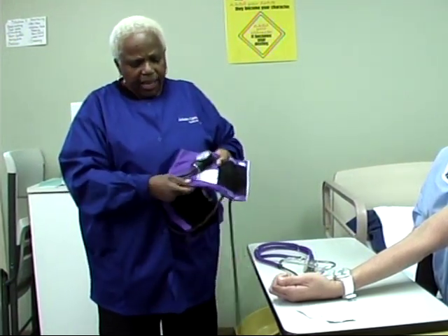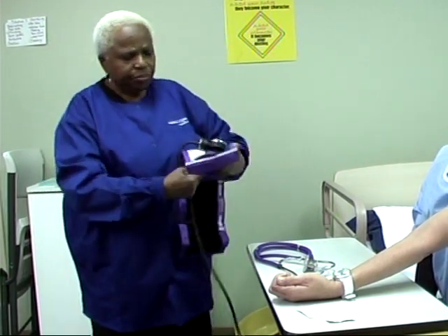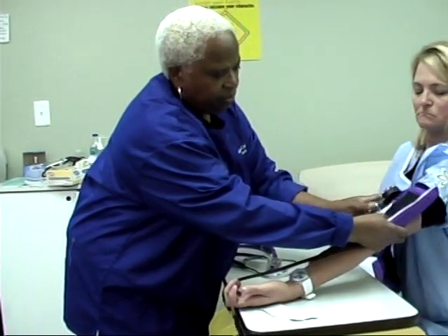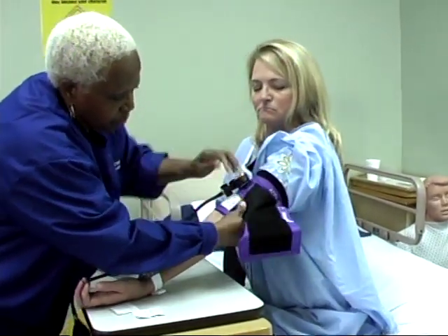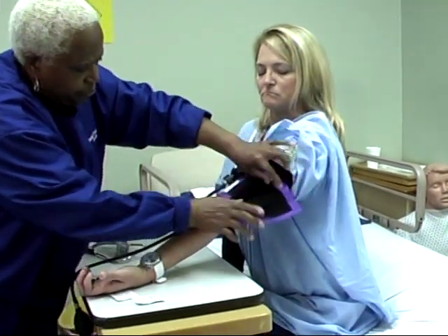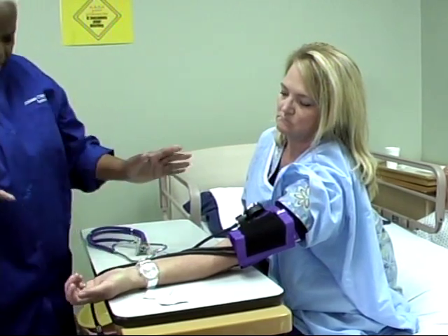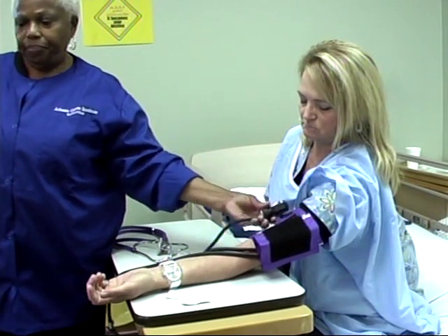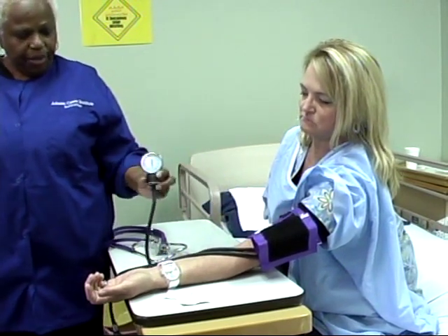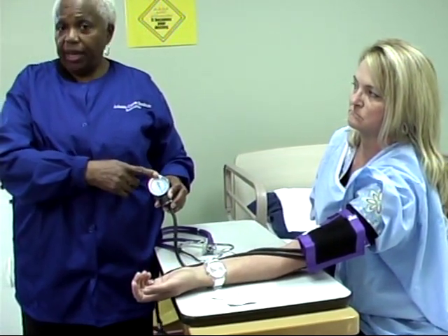You will take the blood pressure cuff and these arrows here have to be over the brachial pulse. Then you lay the arm with the palm of the hand up. When you pump this up, you have to pump it up between 160 and 180.